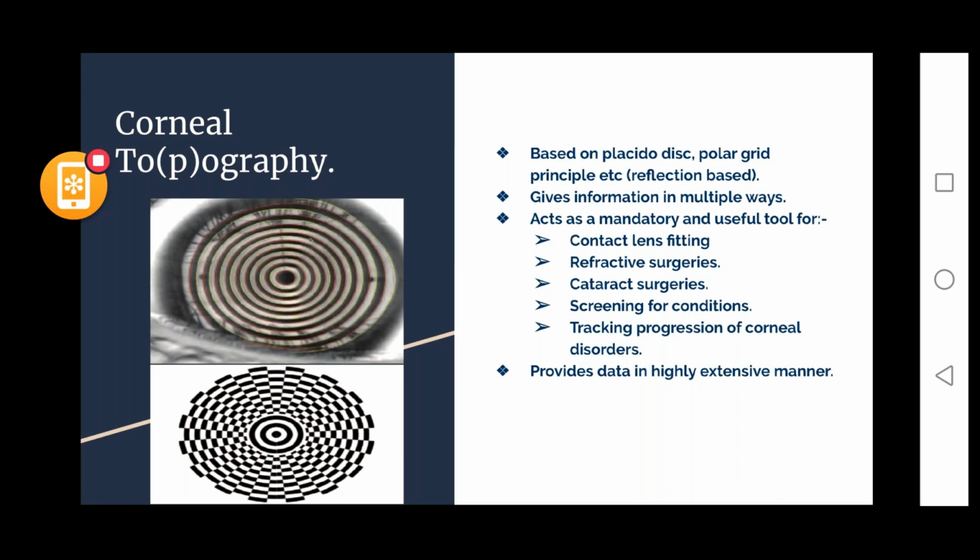Can someone please comment? Yeah, there are various reasons. Most common one is to estimate the post-operative corneal astigmatism, and second one, the area where the incision has to be taken. Okay, very good. But the point of the incision, can it be decided on the table by the surgeon? Why do we need a topographer to do that?